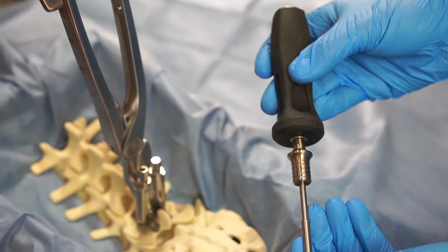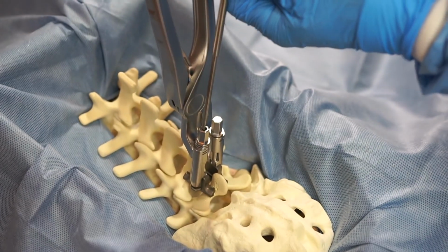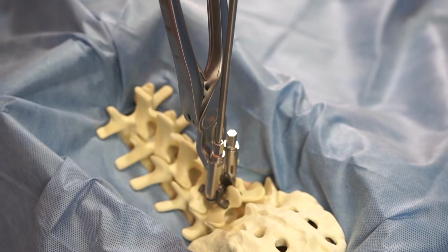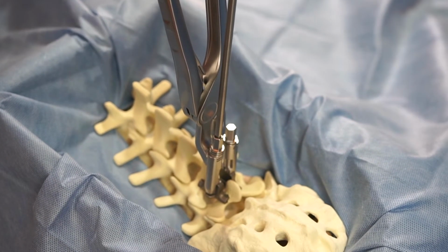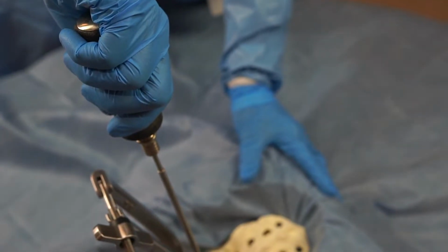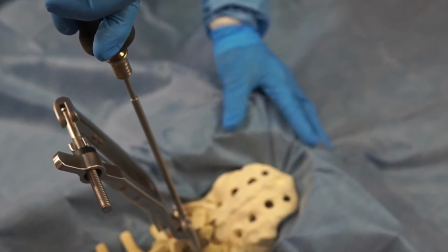Place the torque driver assembly into the PG inserter compressor shaft in the cannulated opening in the lock side of the construct. The driver will guide itself into the lock side of the implant and into the set screw as shown. Tighten the set screw clockwise until the torque handle clicks twice. Once the set screw is tightened to specification, remove the set screw driver.